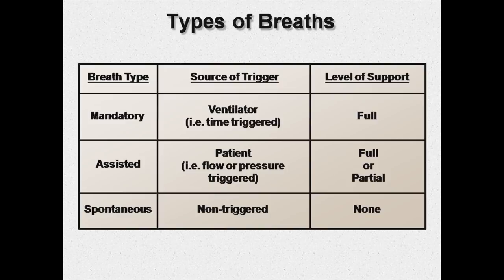Finally, spontaneous breaths are those which the patient takes, which do not trigger any response from the ventilator and therefore receive no support. Most modes allow fully supported assisted breaths to count as mandatory breaths in order to improve patient comfort, prevent patient ventilator dyssynchrony, and prevent hyperventilation.